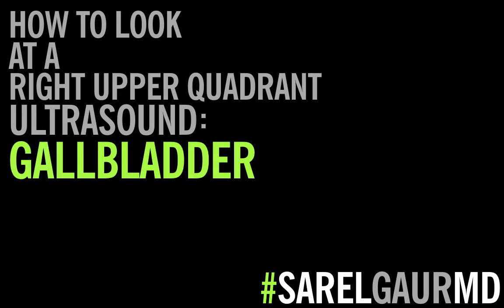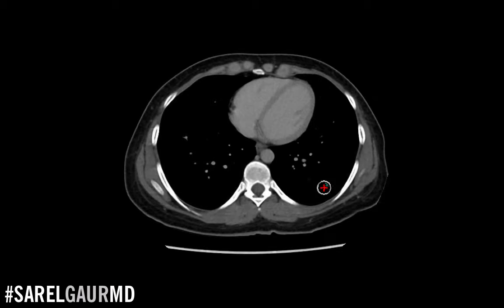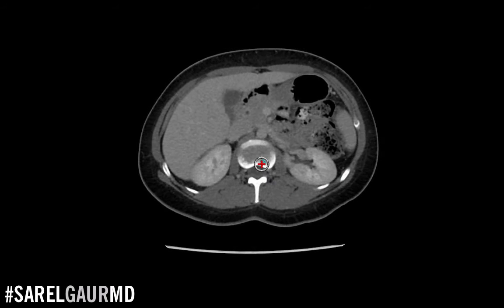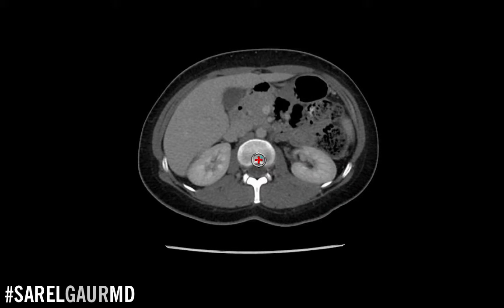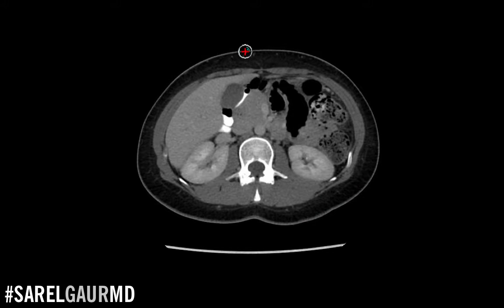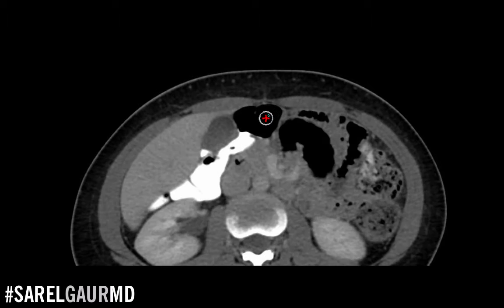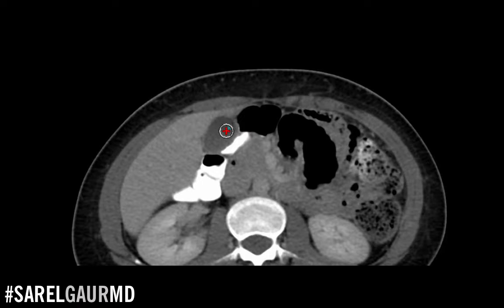Let's start by talking about why ultrasound is the best tool for looking at the gallbladder. I'm actually going to use this CT to show you why. Ultrasound is a real-time dynamic study — we put the probe right on the patient's body. Anything that is superficial, we're going to get a really good look at. You can see on this CT that the gallbladder is relatively superficial — it's just beneath the rectus muscle, just beneath the anterior abdominal wall.